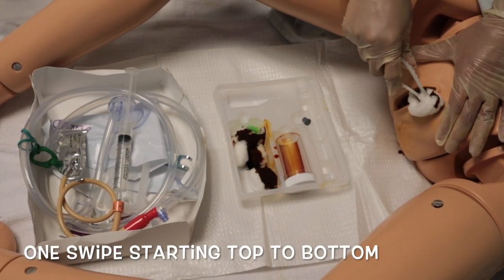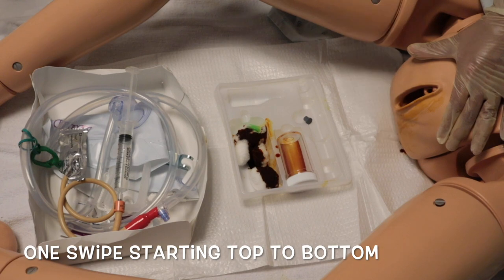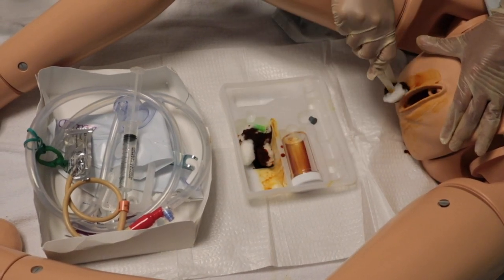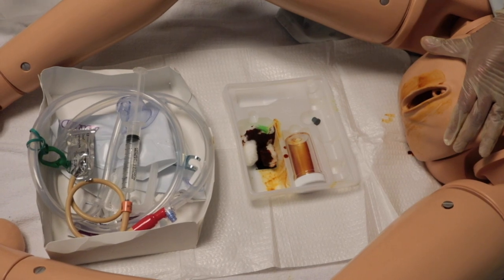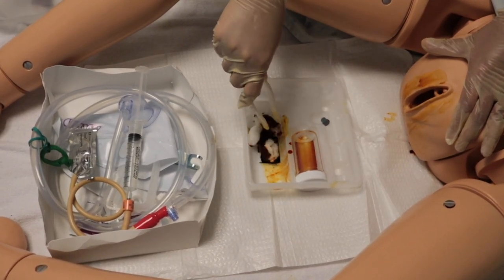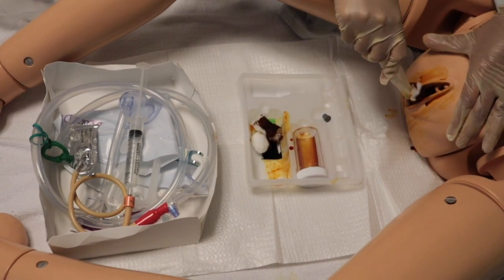One swipe, top to bottom, outer right, outer left, then middle.